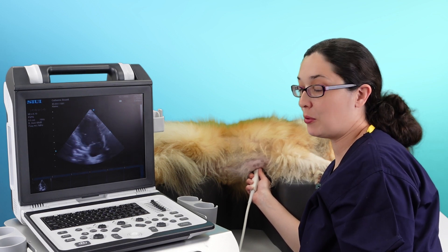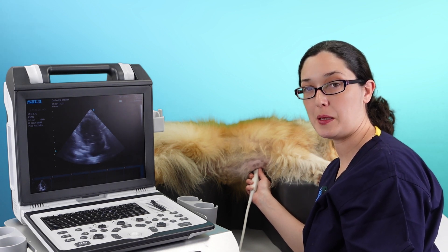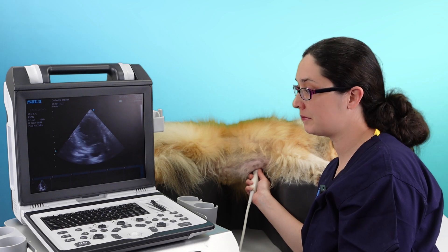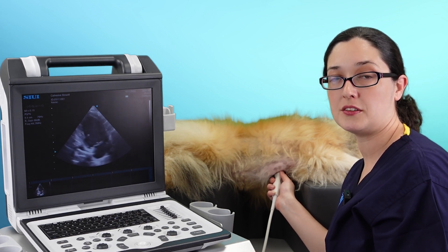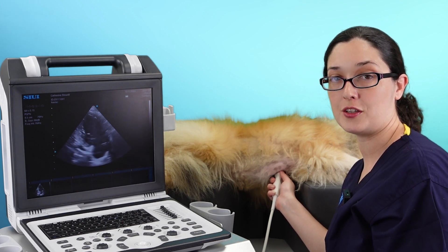You'll also have the left atrial appendage in your view. This is particularly important for cats, where you would check this for thrombus, and you might do a pulse wave Doppler to look at the velocity of blood flow in the appendage as well. It's not quite so important for dogs, but it will be there in your view. Just be mindful if you're judging the severity of mitral regurgitation from this view, that you are actually cutting through the commissures in the two chamber view. So the severity is going to look worse than it would in the four or three chamber views, or indeed from your right parasternal views.